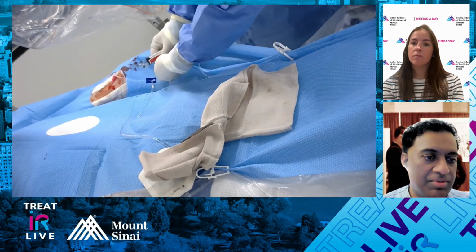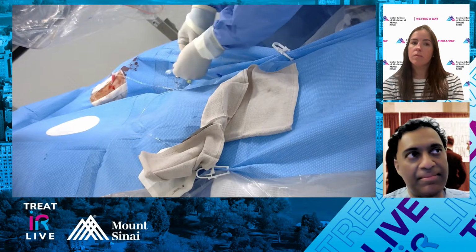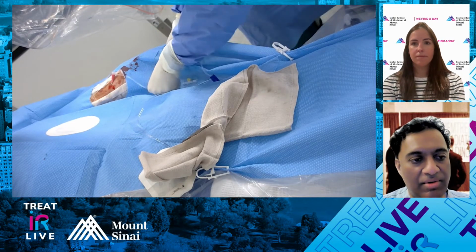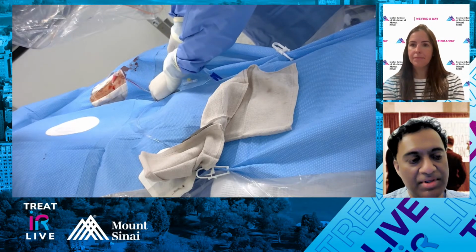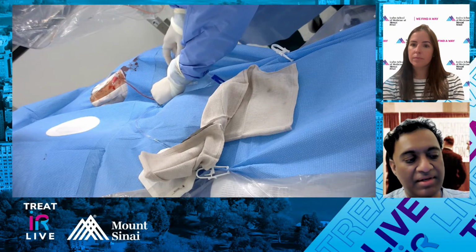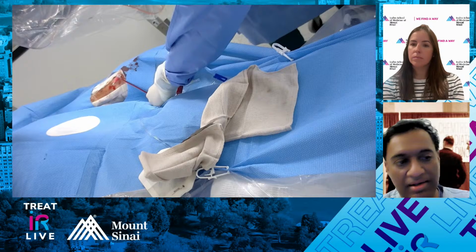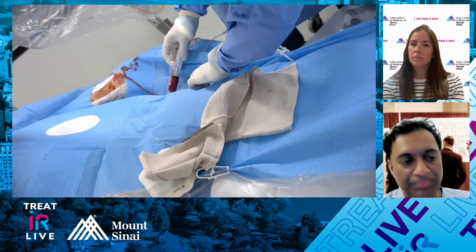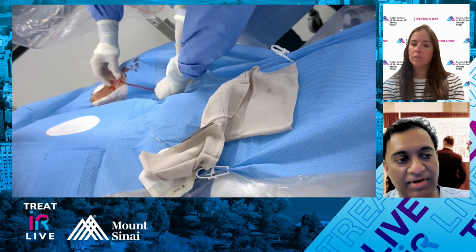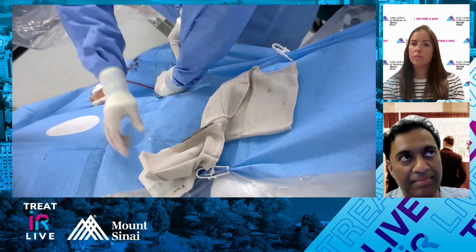But we can also do preservation of the hypogastric, and depending on the diameter of the limb, we have a Gore 23 graft that has a 23 proximal. It's 3 centimeters to the bifurcation, and then a 2.5 for the hypogastric. Radial cocktails going in. Then a 10 centimeter or 12 centimeter long ipsilateral side. So you could deploy that, and it's a fairly flexible stent, provided you have about 5.5.